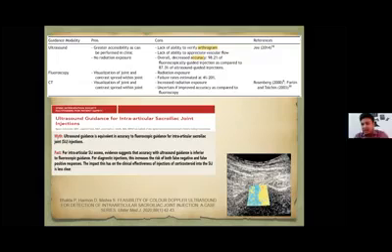So when you're doing diagnostic injections particularly, try to go for fluoroscopy, because you want to be sure and you want to pick all the patients. You don't want to miss them. While if you're doing therapeutic injections, you can go for ultrasound.